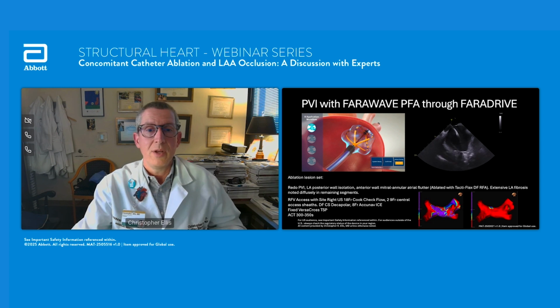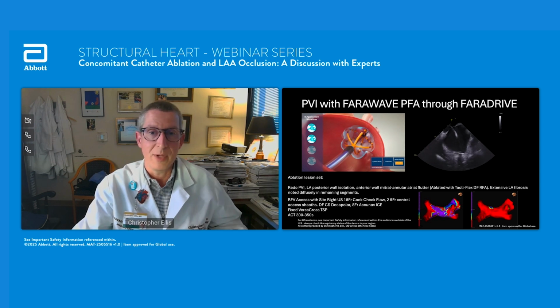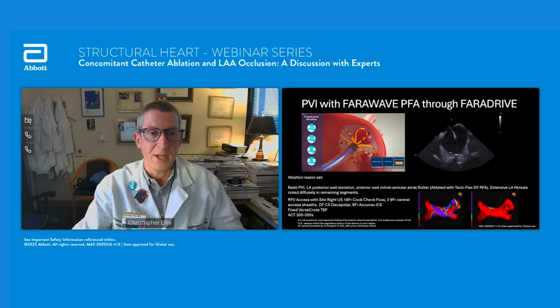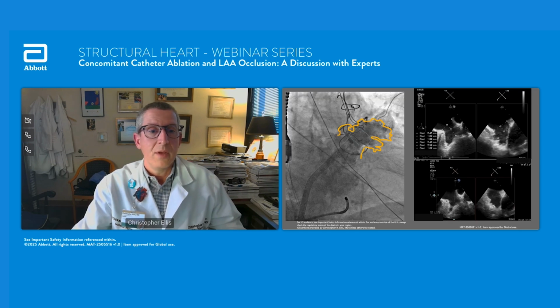I don't know if you do that for every standalone appendage or just your concomitants, but I generally have such a wait time from when I see a patient in the office till I do it. There's lots of time to get a CT, and if they get it locally, that's fine as long as I get the images. Most of the time I try to encourage them to get it at our center because it's much easier to download on the day of the procedure.